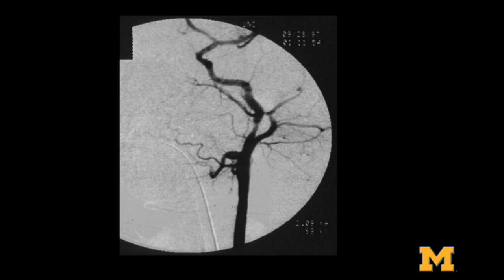But now this has been replaced by a variety of cross-sectional studies. So just by a show of hands in the audience, if someone comes in with a potential carotid dissection, how many people still do angiograms as a first line? Pretty much nobody, right? How many people are doing CTAs? And how many people are doing MRAs? That's interesting. So that's about a third to two-thirds. So if either one is fine, in fact, we have this internal debate in our own division.